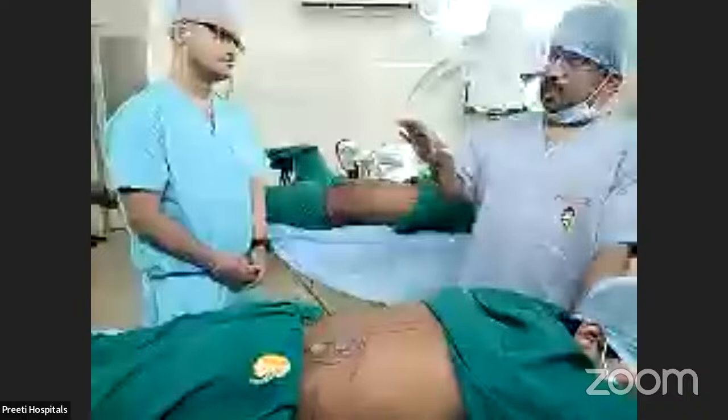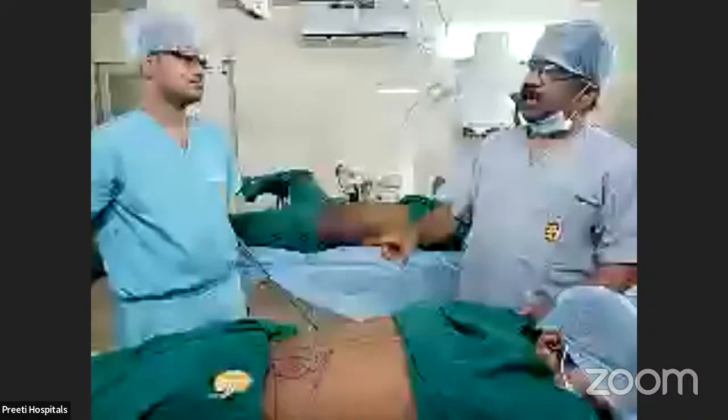Now, same combination, if it is upper calyx, middle calyx and pelvis, and large stones are there, what will you prefer? I will prefer prone PCNL. For all large stones in the upper calyx, there is a slight preference to prone because you reach the most posterior part. Here the track to travel is very short because you go vertically down directly to the stone. Here a long track will be there horizontally to reach the stone.